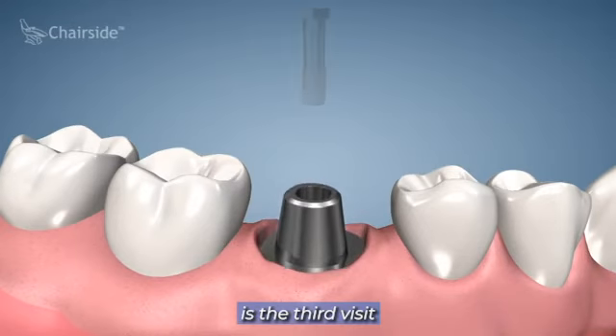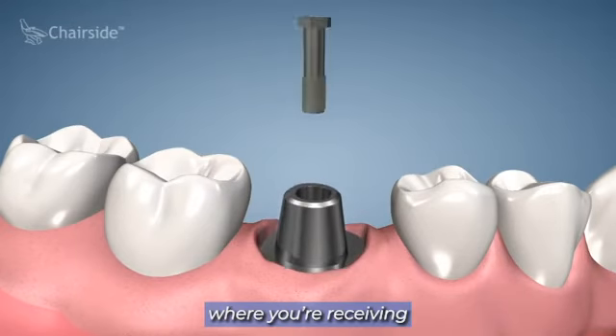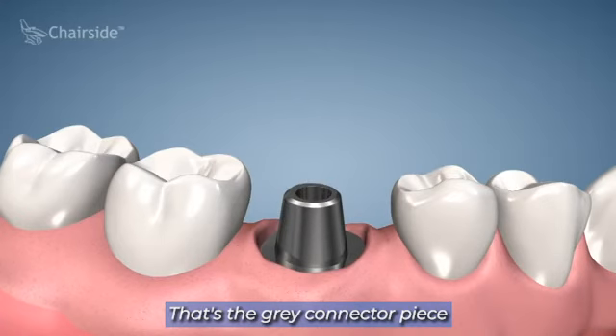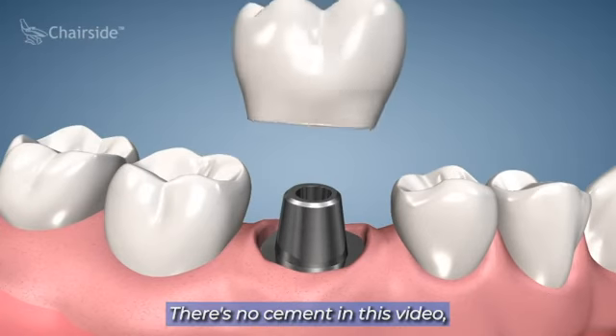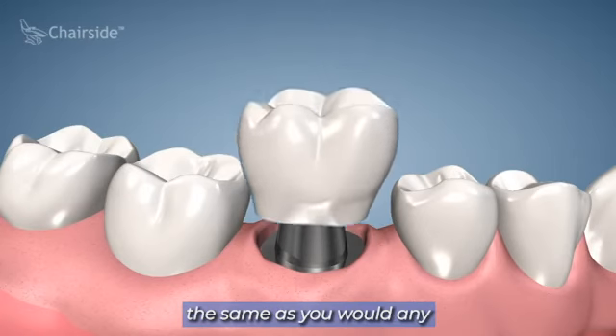Now what they're showing is the third visit, where you're receiving what we call the abutment — that's the gray connector piece placed on the implant. Then they're showing the cementation of the crown. You would cement this crown the same as you would any other crown on a tooth.